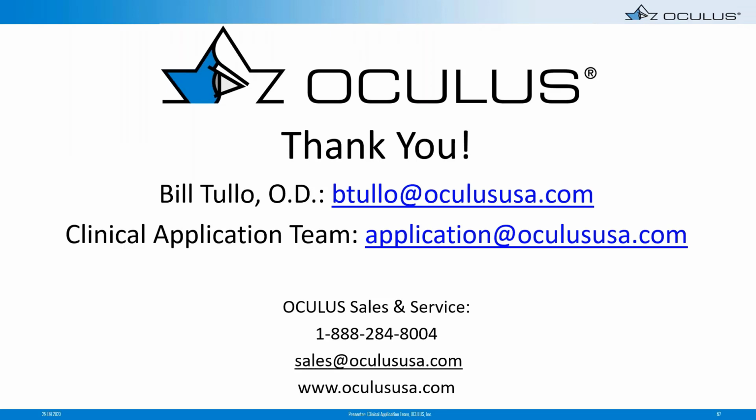So I guess the answer to the question is, for normal eyes, I think any changes that do occur with time of day are clinically insignificant. But with abnormal eyes, you can definitely see differences in scans from morning to afternoon to evening. I have some of my patients, particularly my Fuchs patients, come in either first in the morning or last in the day, so I can actually look at those variations, because the symptoms of the patients usually follow those variations also. I hope that was the hardest question, Carver.